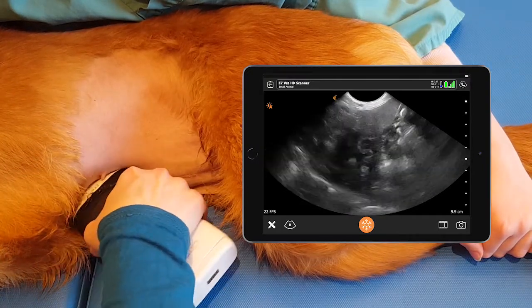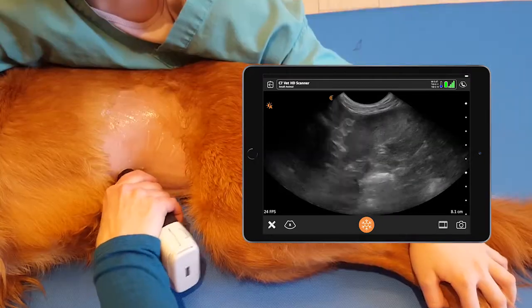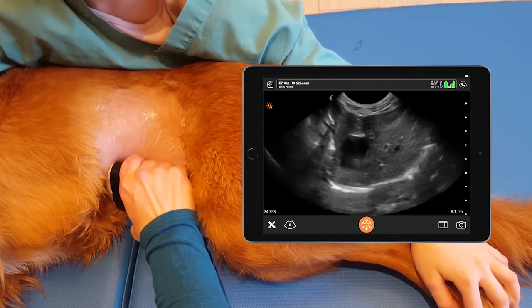If we return to the mid-sagittal view, we can rotate the probe 90 degrees and get a transverse view of the gallbladder and the liver.